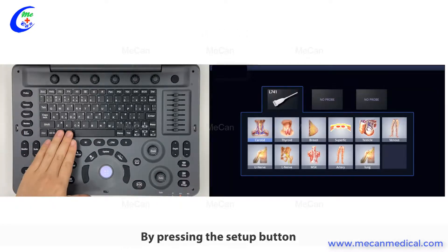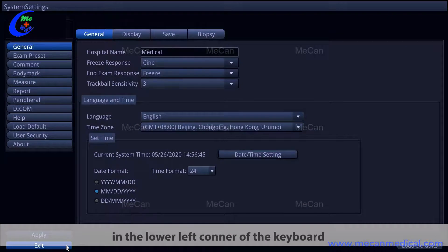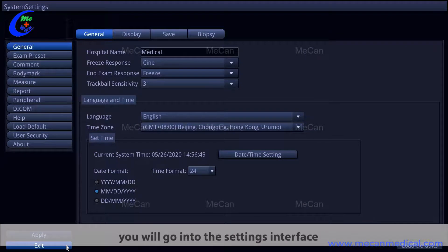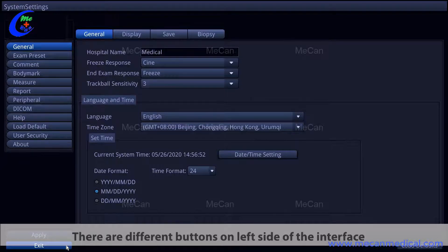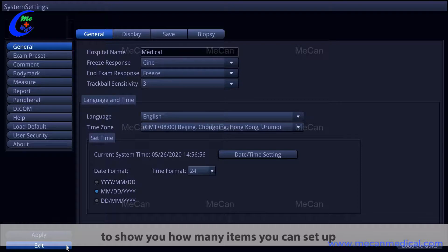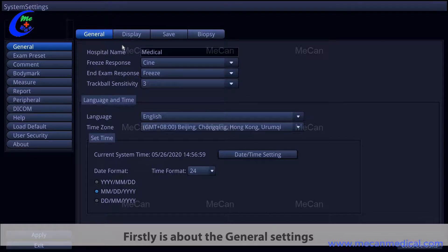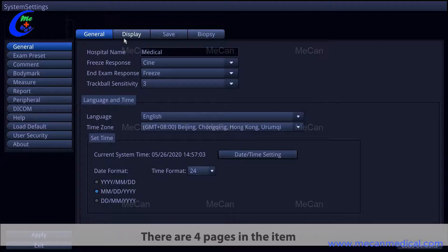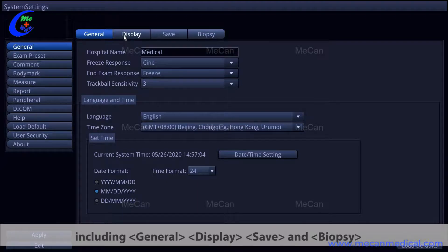By pressing the setup button in the lower left corner of the keyboard, you will go into the settings interface. There are different buttons on the left side of the interface showing all the items you can set up. The first item is general settings, which has four pages: general, display, save, and biopsy.